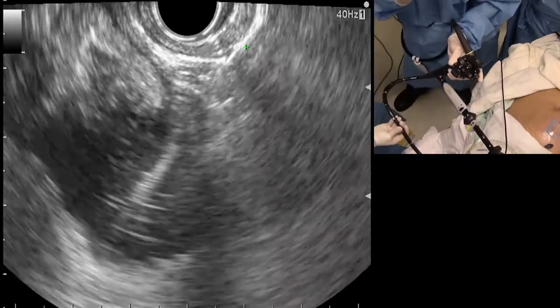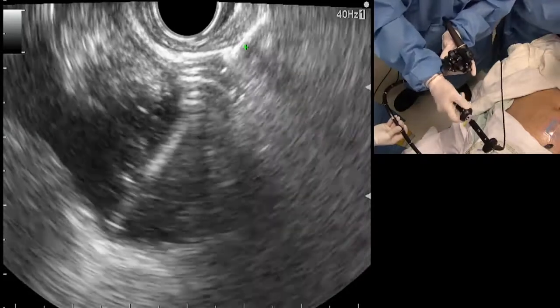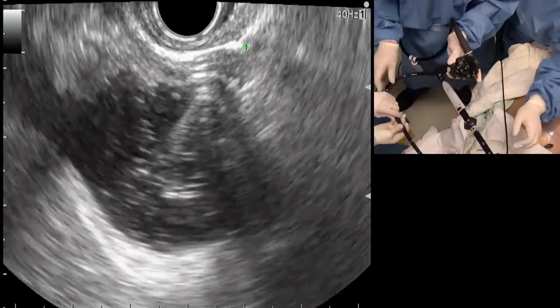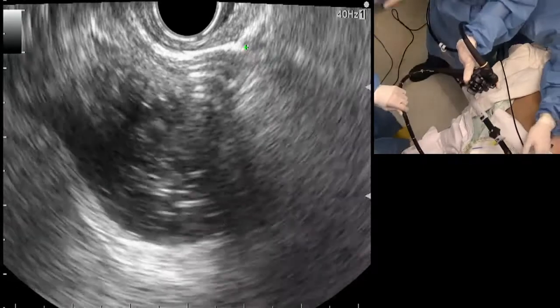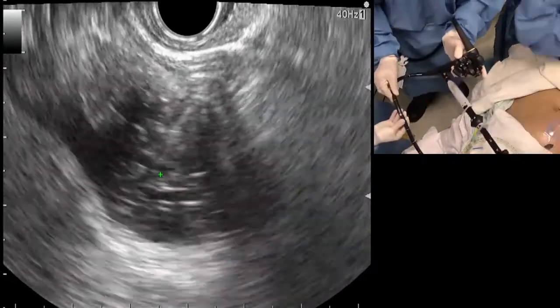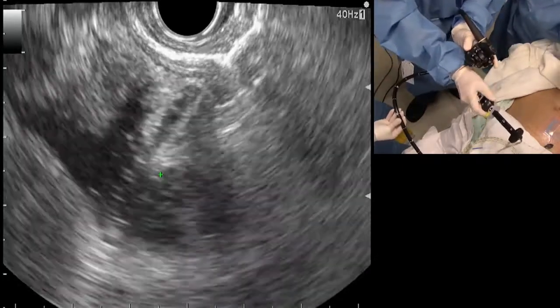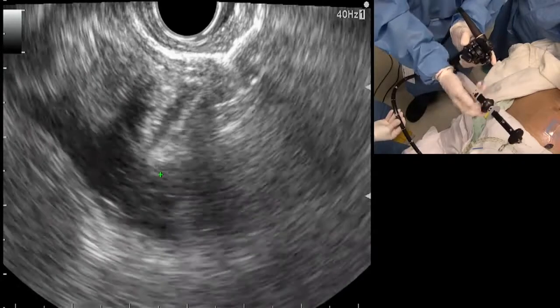Now, this is the tactile. This is why this will never be done by a robot, because the tactile is so key, and my sheath is in. You see it at the tip here. Hopefully, you can appreciate it there. I'll try to get a better view for you in just a moment. But now that I'm in, I pushed it as far in as I could see it. I'm going to lock now.